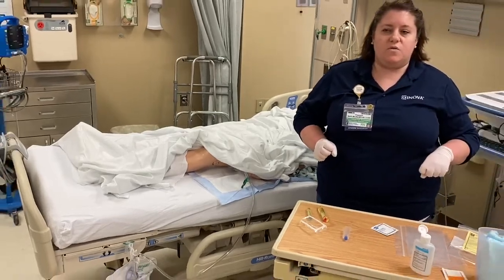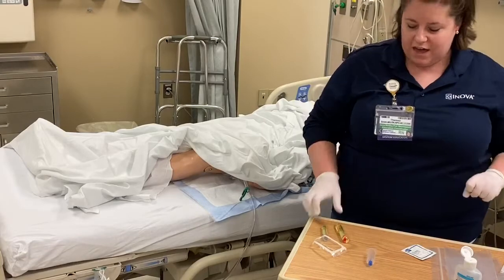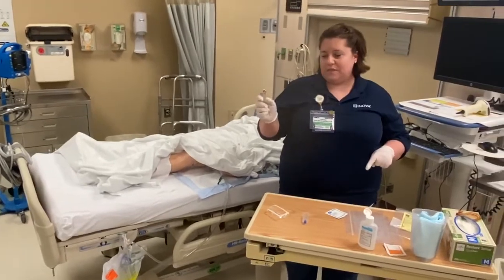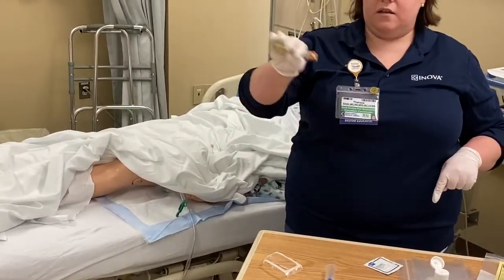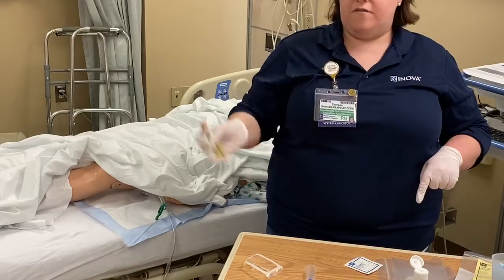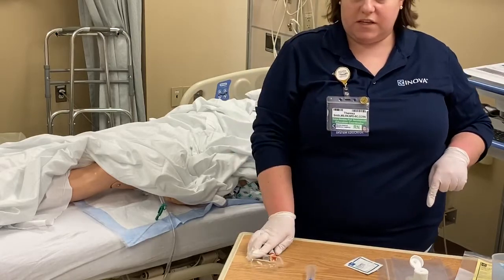And I'm going to go to my computer because I need to print my labels. But before I do that, I need to invert my tubes. So I have them in my hand, and both of these tubes get inverted 8 to 10 times. Okay, so that's a figure 8 pattern. 1, 2, 3, 4, 5, 6, 7, 8. All right, so I'll set those down.